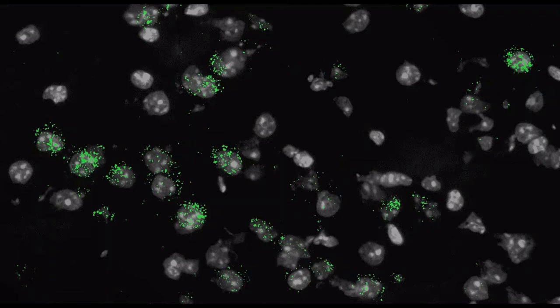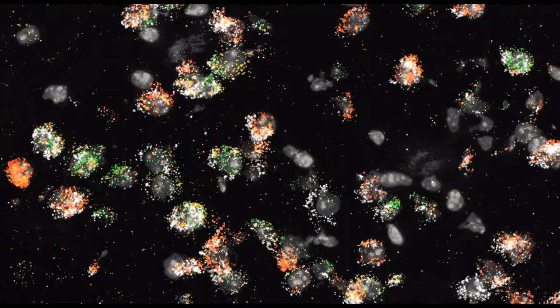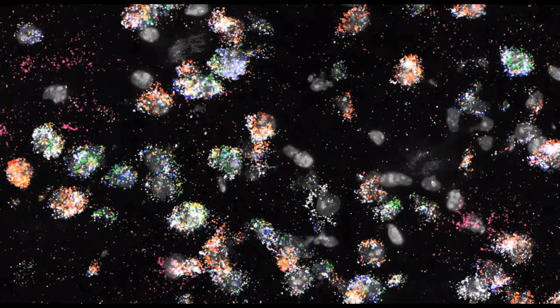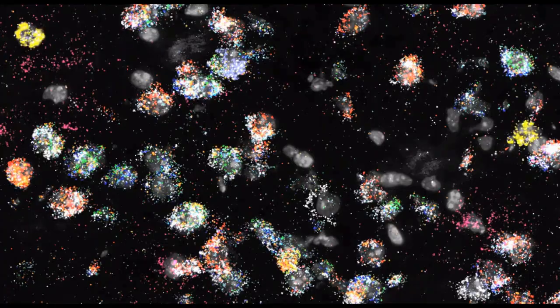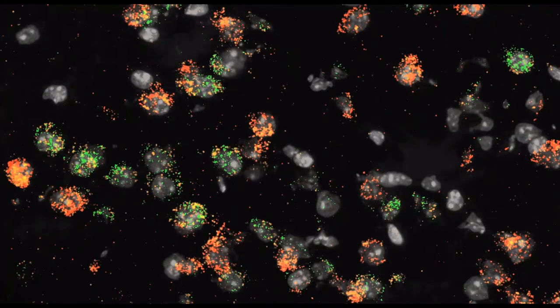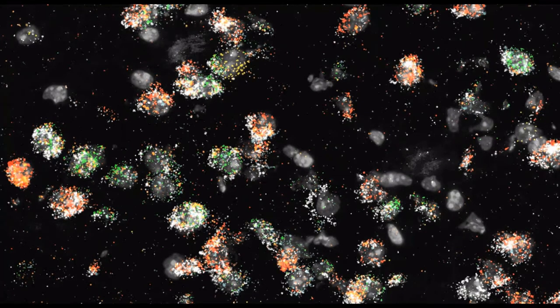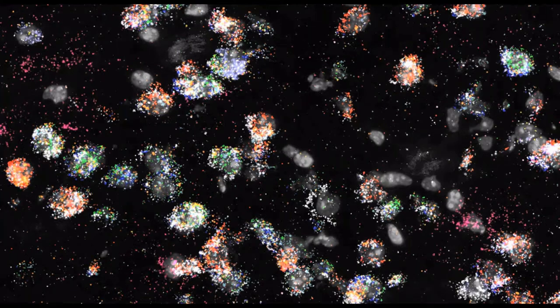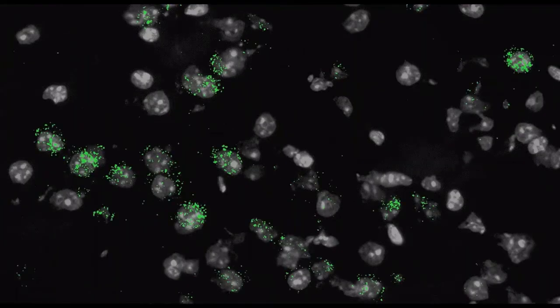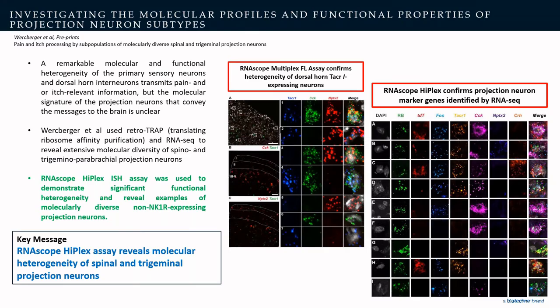This slide is a graphic that was created using online tools, showing you the power of this assay and our image registration software, and allowing you to visualize the heterogeneity of these cell populations on, again, that single tissue section. But this is just showing you an application of this technology, but I did want to show you an example of how one of our early researchers that used this assay applied it in pain research.